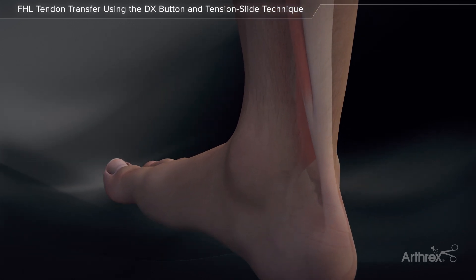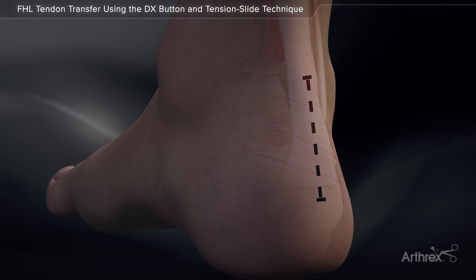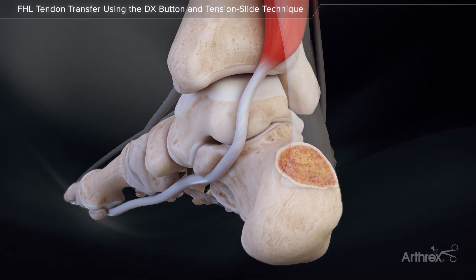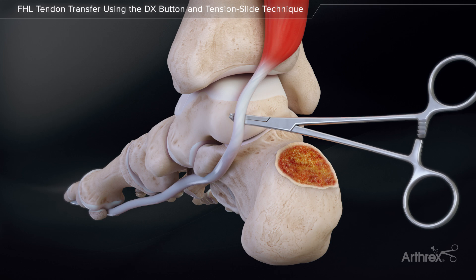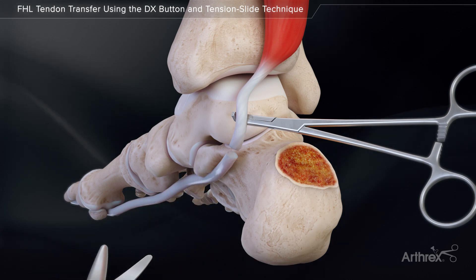Flexor hallucis longus tendon transfer with DX button and tension slide technique. Make a 5 cm to 7 cm longitudinal incision through the midline of the Achilles tendon. Use fine scissors to make the incision deeper until the FHL tendon and its muscle belly are identified. Confirm by flexion and extension of the hallux. Retract the neurovascular bundle, expose the tendon, then cut the FHL as distal as possible.